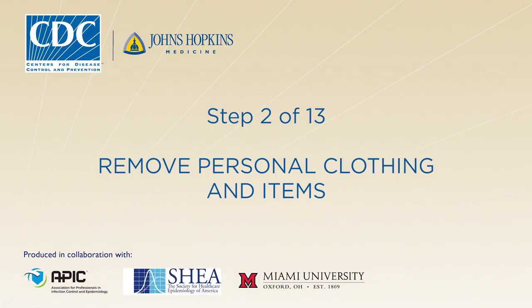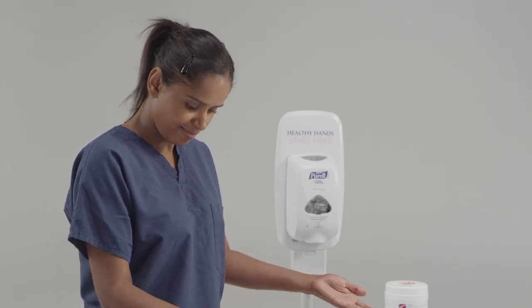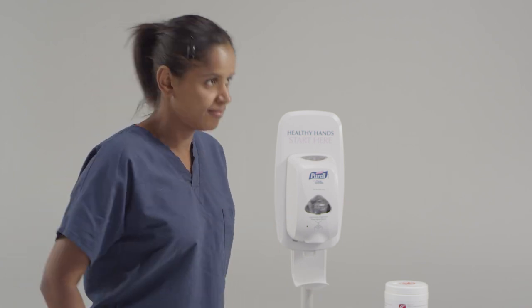Before starting the donning procedure, change into clean surgical scrubs or provided disposable garments and dedicated washable footwear, such as plastic or rubber materials, in a suitable, clean area. All footwear should be closed toe and closed heel with no holes. No personal items such as jewelry, watches, cell phones, pagers, or pens should be brought into the patient room.